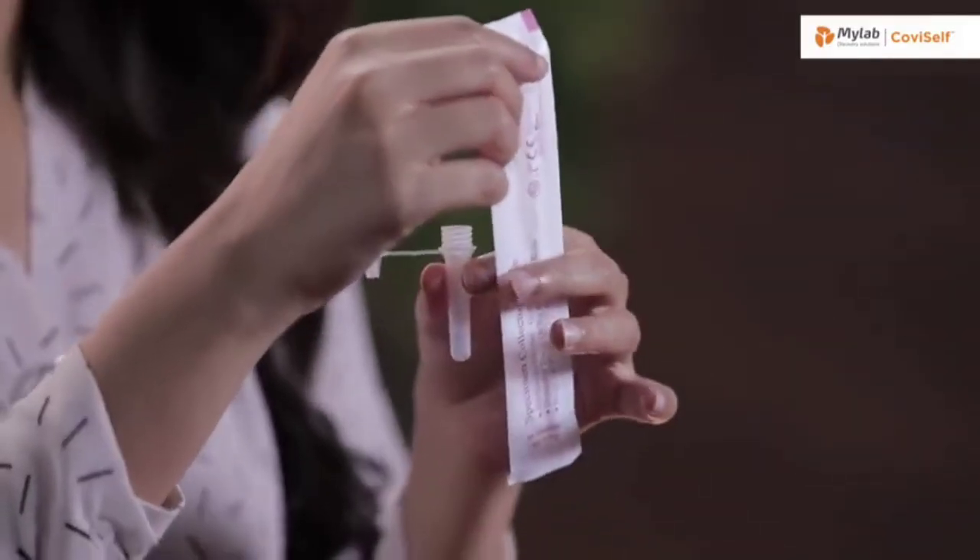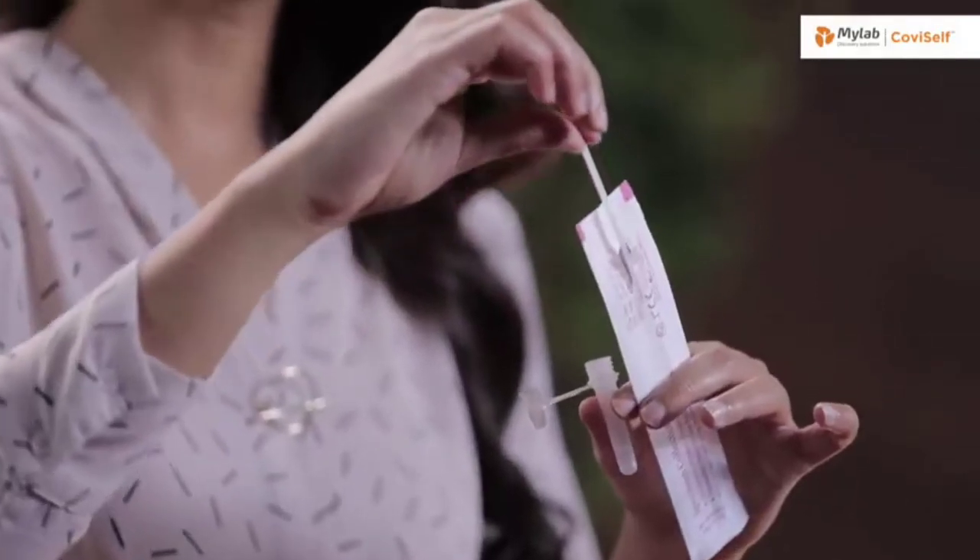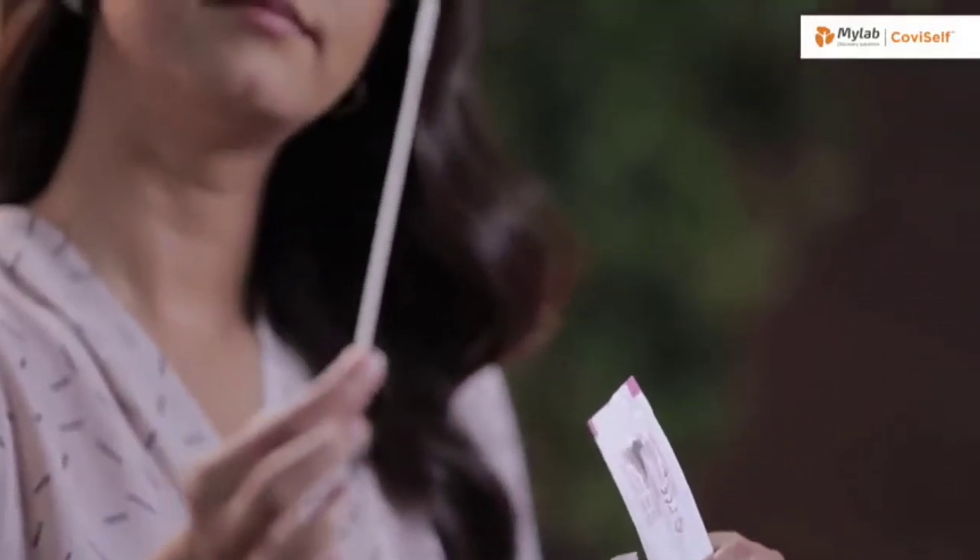Open the sterile nasal swab while holding the tube in your hand. Tear it from the tail end. It's important that you do not touch the swab head. Carefully insert the sterile nasal swab in both your nostrils one after the other, up to 2–4 cm or until resistance is met. Roll the swab five times inside each nostril. Your nasal swab is now ready for the test.